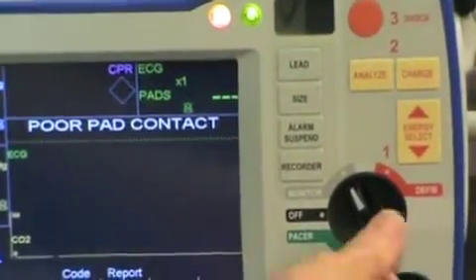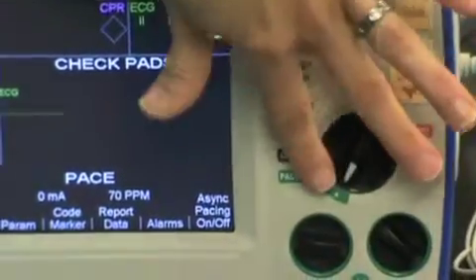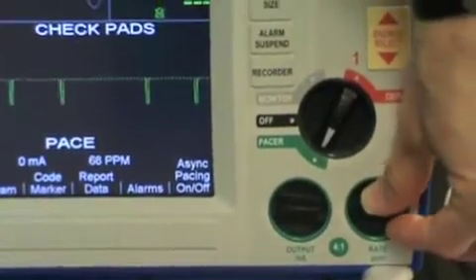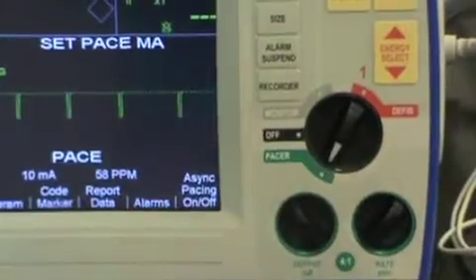The next one is the pacer function. So that's for somebody who had a really low heart rate. You could adjust here with rate and with the milliamps output.